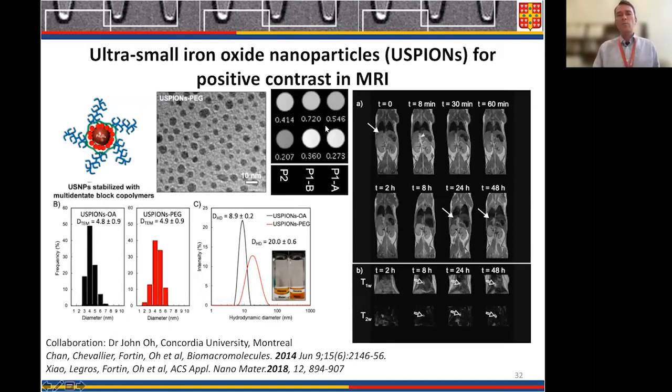And this is where we started to use more and more the MR system for in vivo injections and mice monitoring. Here you have a demonstration of systemic, intravascular injection of ultra-small iron oxide nanoparticles. So this is before injection and then after injection. And you can see that the blood signal increases in the first minutes after the injection, and this signal enhancement is kept for at least 1 hour after the injection.